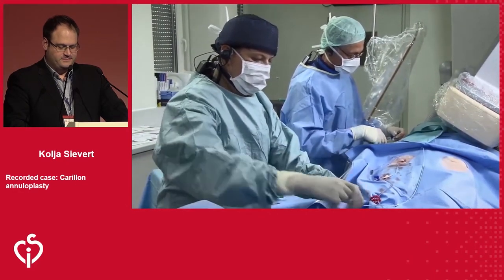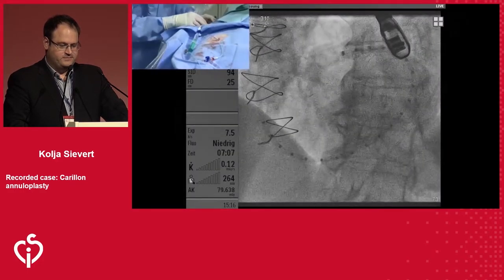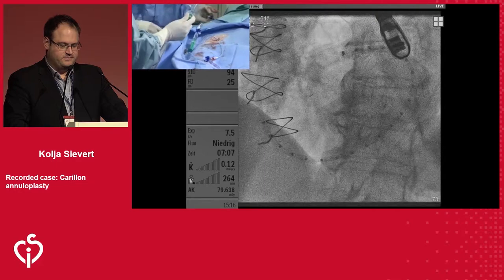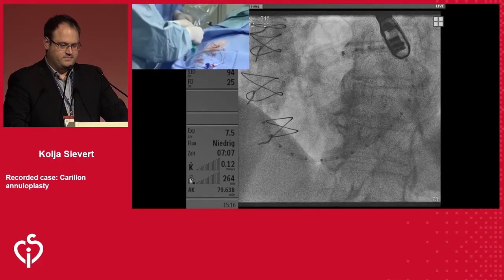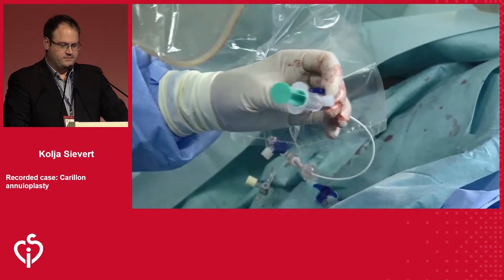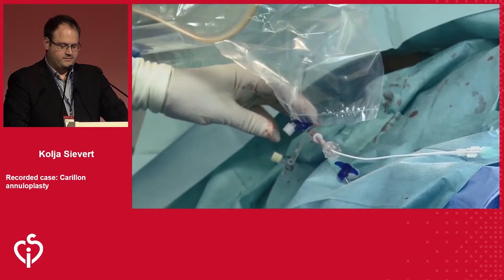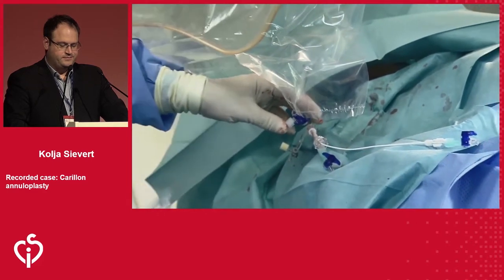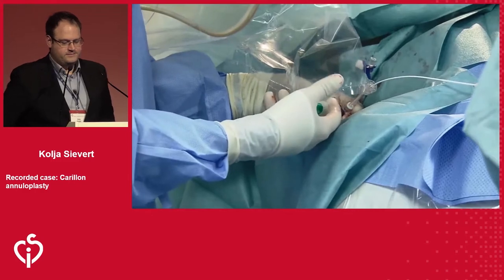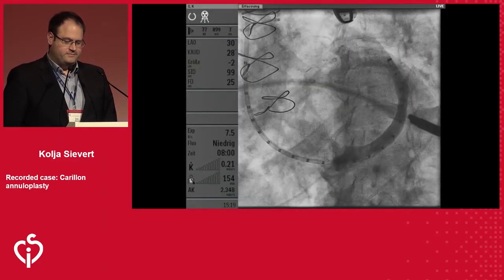Marker catheter. Yeah, we need a marker catheter for that. Back from your catheter? Yes. Okay. Yes, and it's de-aired now. Okay. Good, so now we need some contrast. Should we go to caudal projection at this time? Caudal, maybe 30-degree caudal, no, and RAO caudal. LAO, sorry. Okay, I have the sinus. It moved down now. Okay.